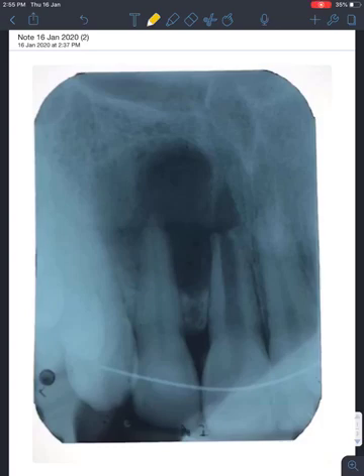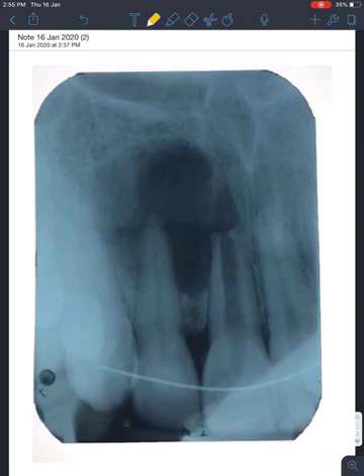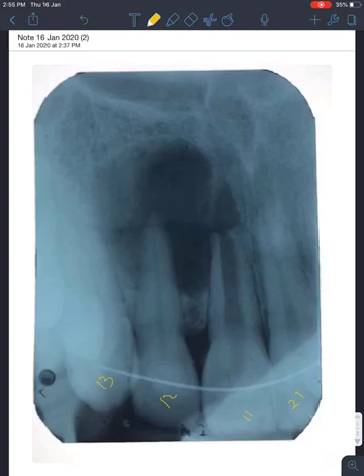We're doing a radiographic interpretation. Which quadrant is showing? First quadrant. We're showing teeth 2-1, 1-1, 1-2, and 1-3. Can you identify what this tooth is here? Probably 1-4, yes.